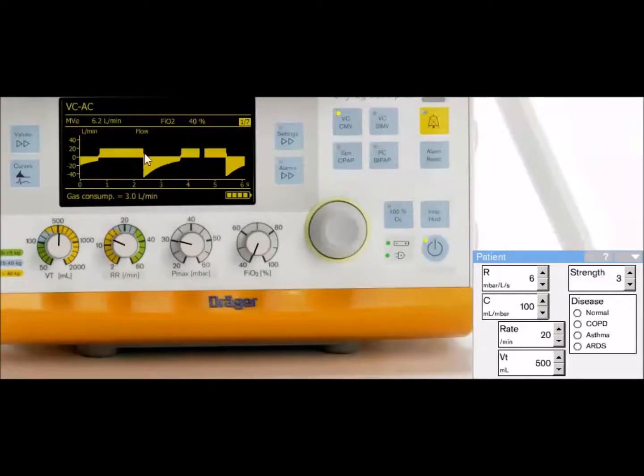So as you notice, my inspiratory time does not change. I still have this long inspiratory time. It's fixed. The ventilator's not changing it, and you can see with the flow waveform that it doesn't return to baseline, which is evidence of air trapping, dynamic hyperinflation, or auto PEEP. So volume control CMV with dual targeting does not provide automatic adjustment to prevent auto PEEP.